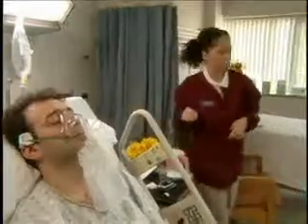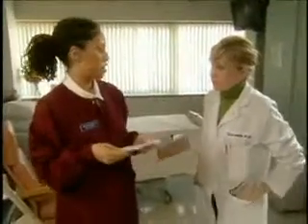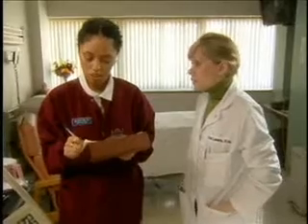Okay, everything looks great. So, right, I'll document, including my assessment, the type of mask used, liters per minute flow, and the patient's reaction to the procedure. Great. Now, skin integrity can be compromised due to moisture and pressure under the mask. So regular assessment of the area under the mask is an important part of care.